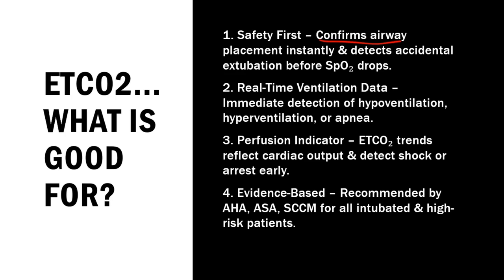So knowing this can help us drive our ventilator care. If we know, hey, she's acidotic, she has a pH of 7.1, let's try to maintain her respiratory rate where we get an end tidal of 20 to 25. All right. So end tidal is a great tool.